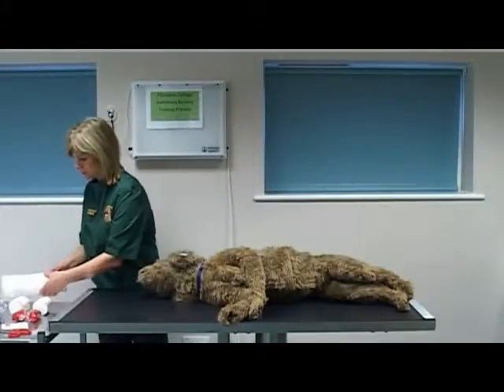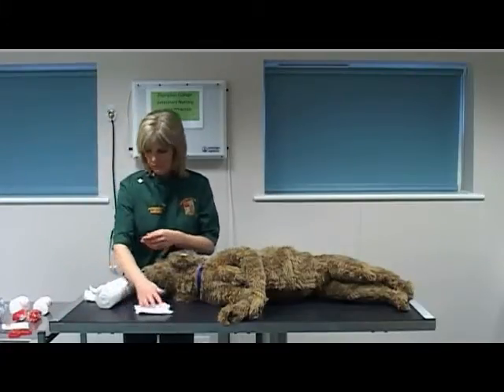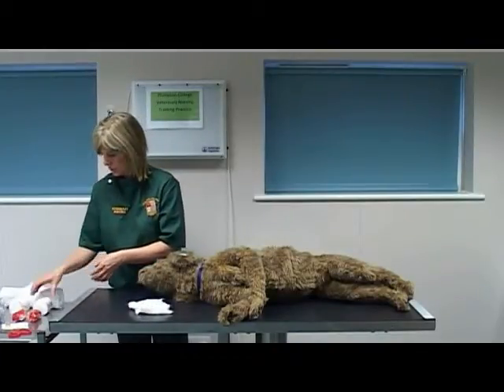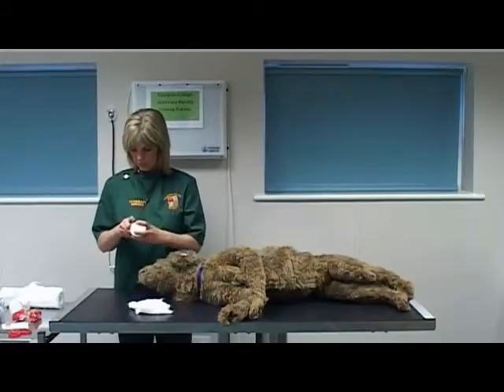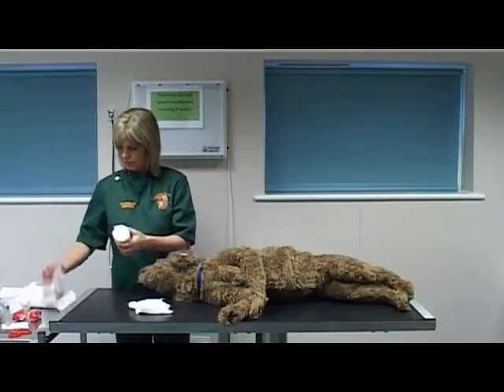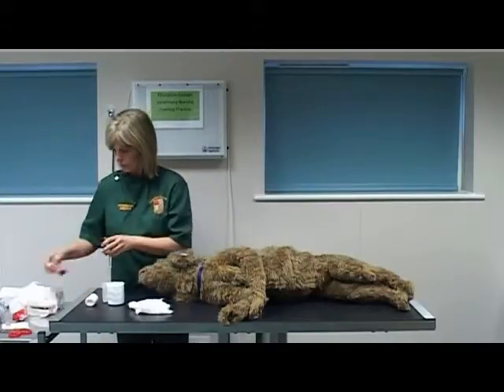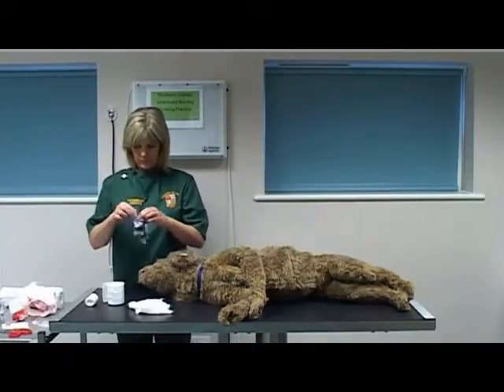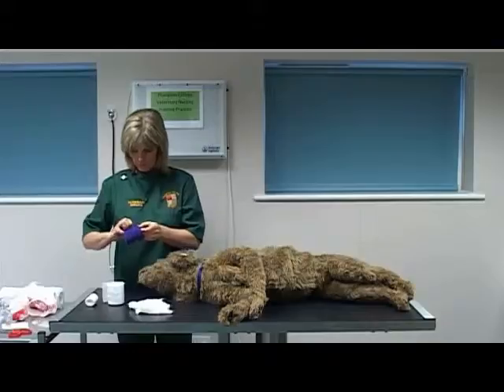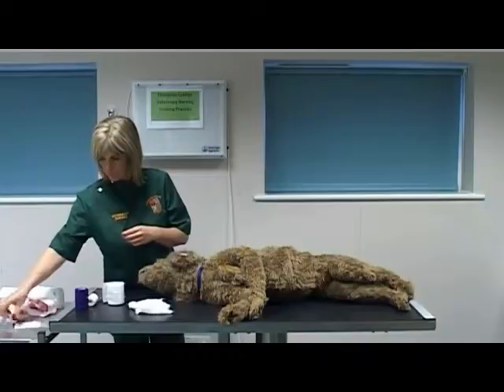Select and unwrap materials and equipment prior to starting the bandage. Select a small amount of padding. Select a synthetic bandage. Select a conforming bandage. Select a protective layer. Select a pair of scissors. Select a wound dressing.